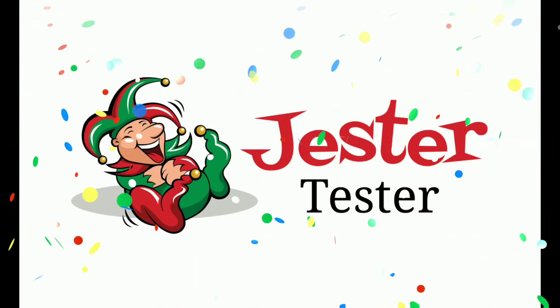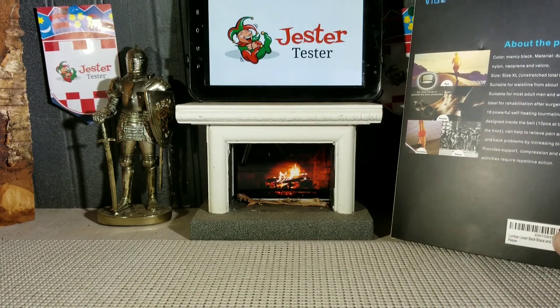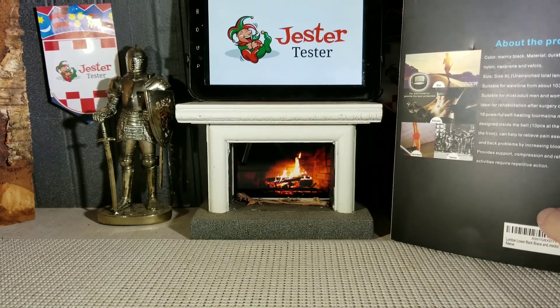Jester Tester, an honest review for you! Hello everyone, Jester Tester is back with another review. This time, we are reviewing the Lumbar Lower Back Brace by VigorLaser.